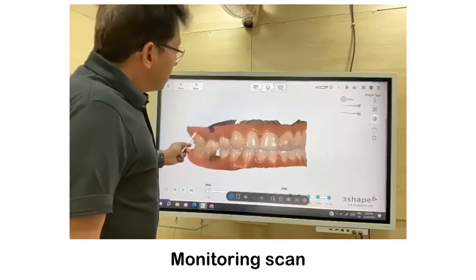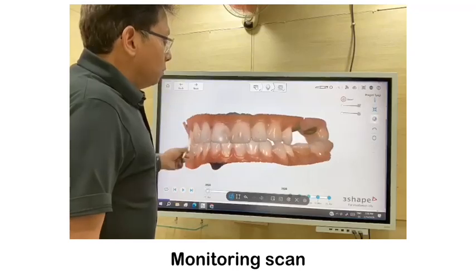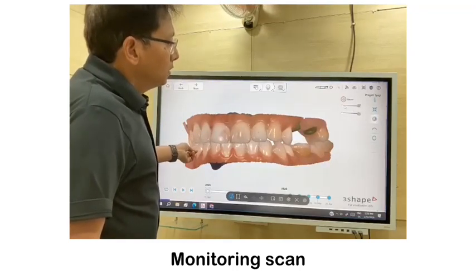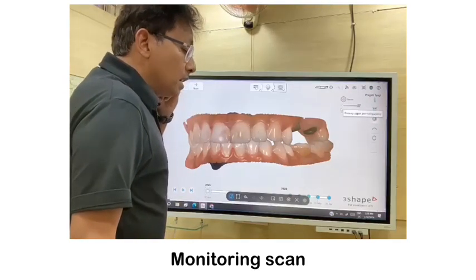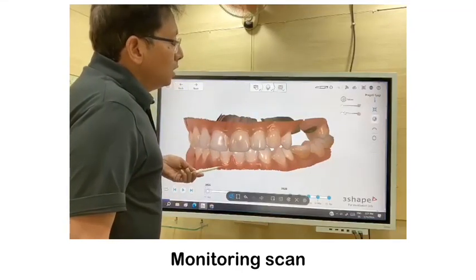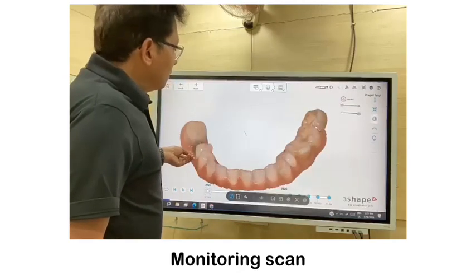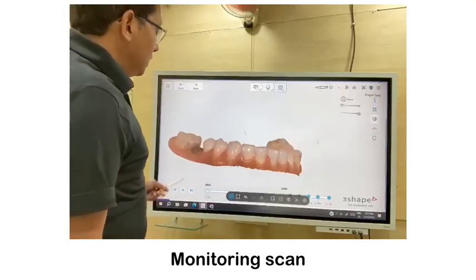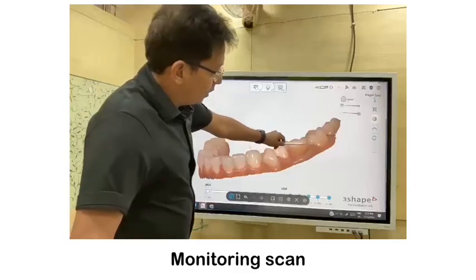This is another case of bite imbalance correction. The patient is 33 years old and she has a history of TMDs, ear blockage, tinnitus and jaw muscle stiffness, and intraorally she has been going to a dentist and also to me for multiple teeth treatment. She got one tooth root canal and only was placed here. One tooth root canal only was placed here.